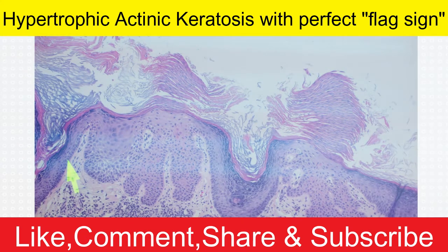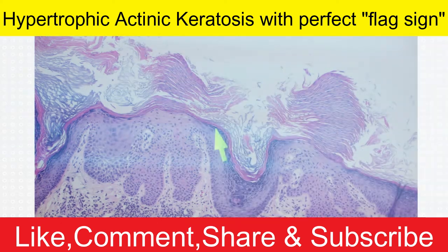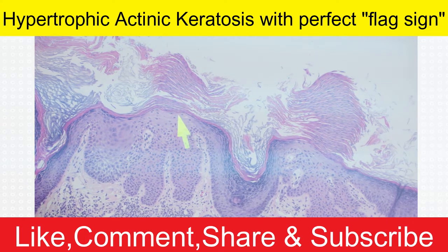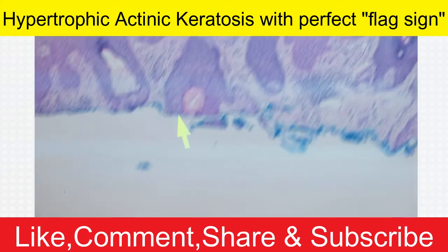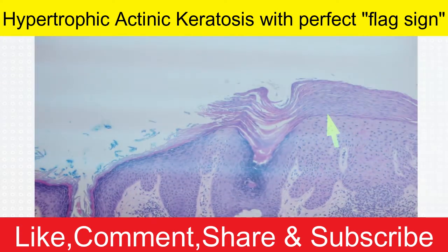But when the epidermis is growing too quickly, for whatever reason, the granular layer never has time to develop, and normally the granular layer plays a role in the cell breaking down and turning into a normal stratum corneum. Actually, this area over here shows it best: here you have loss of the granular layer, and then you've got parakeratosis on top. Over here, right next to it, you have a nice thick granular layer and orthokeratosis on top.